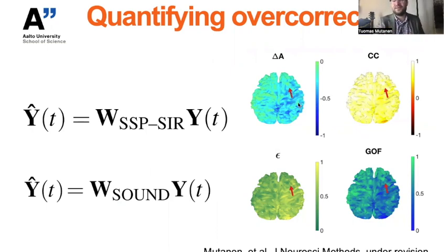And in this specific example, we can see that, for instance, removing the muscle artifacts would indeed attenuate the cortical sources close to the coil. But if we are interested in cortical connections, for instance, on the contralateral hemisphere, we can quite safely measure those responses even after cleaning. So that's very nice. These methods allow you to quantify the level of overcorrection.